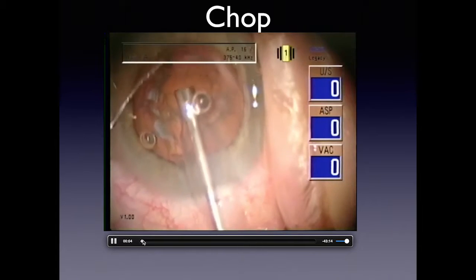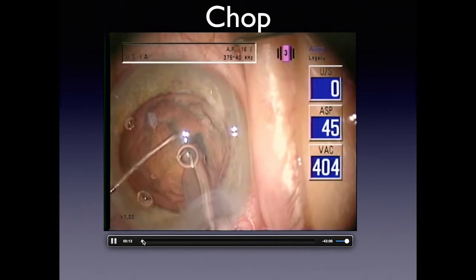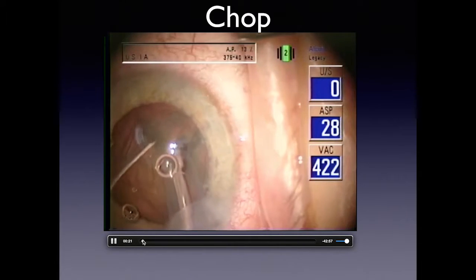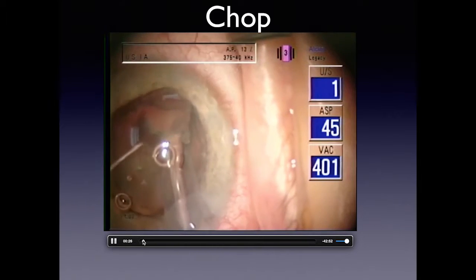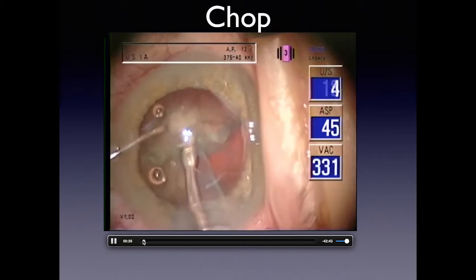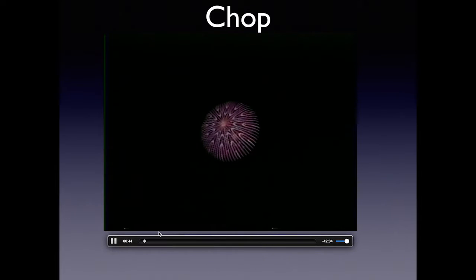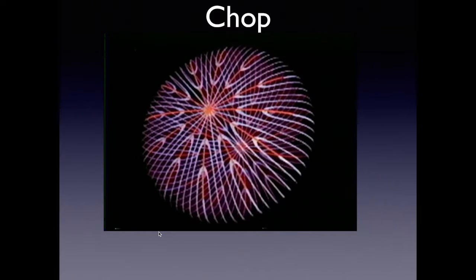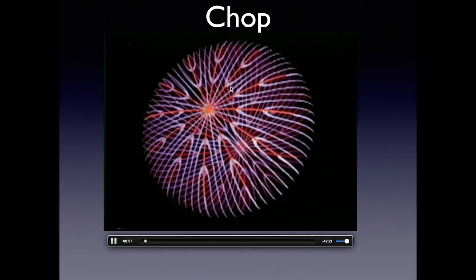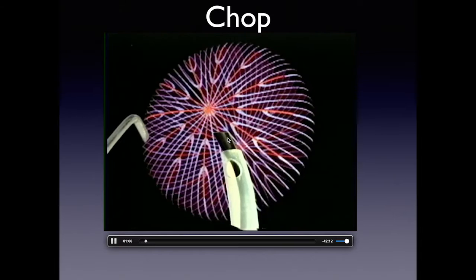In this video you'll see different techniques. The phaco tip is buried in the nucleus and the second instrument allows easy cracking. Go to foot position three, back to foot position two, then the non-dominant hand performs the actual cracking. This drawing shows what any kind of cataract looks like — you have to understand the natural lines that allow you to divide the nucleus into quadrants or six or eight pieces. The phaco handpiece comes in, the dominant hand does not move, and the second hand removes the piece.